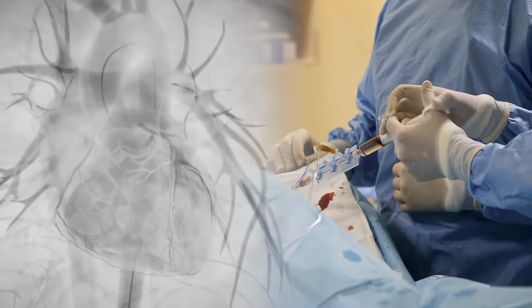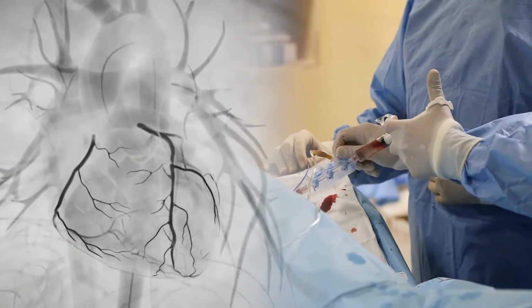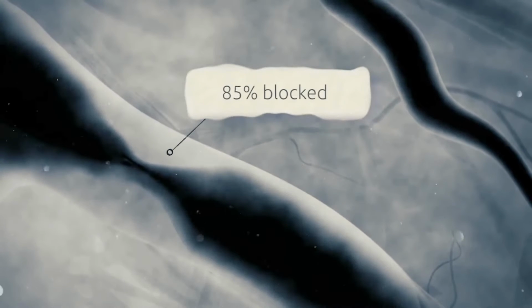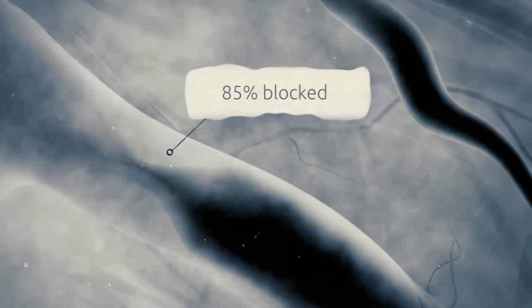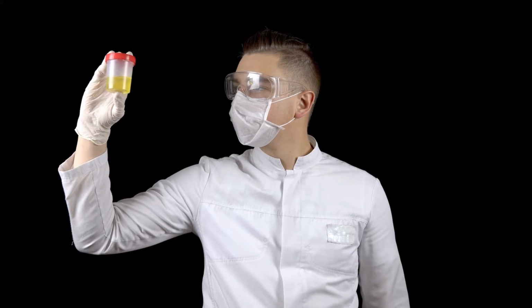Once the catheter is in place, your doctor will inject a liquid dye through the catheter. The dye makes the blood flowing inside the blood vessels visible on an X-ray and shows any narrowed or blocked area in the blood vessels. The dye is later eliminated from your body through urine.